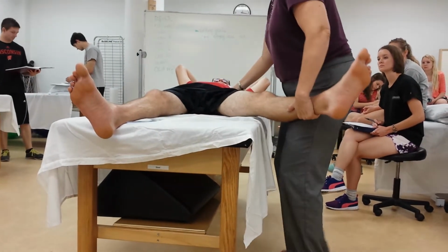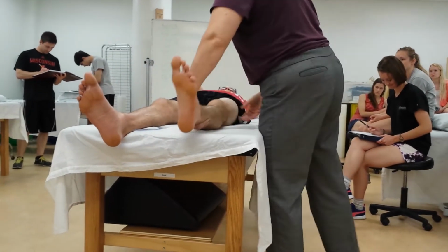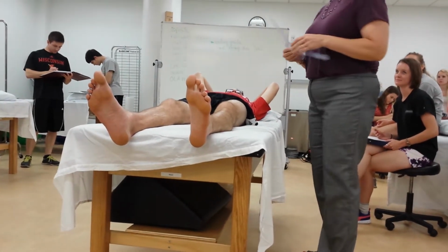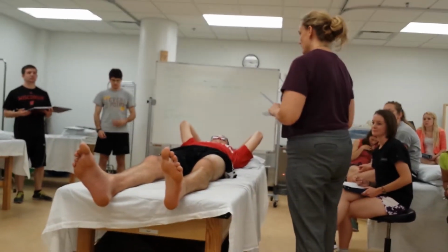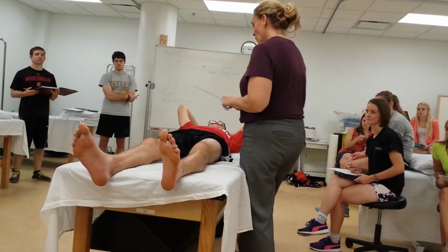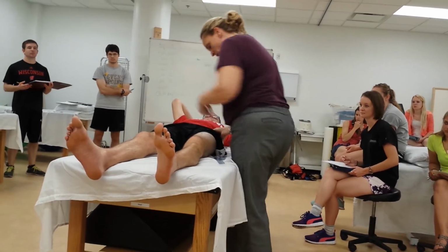All right, abduction. Going to feel for end feel. That's definitely muscular. Okay, so now we're doing a motion in an orthogonal plane. Where do you think the stationary arm would go? Between the two ASIS. So for this one, we are going to go across the ASISs. It's a little bit different than how we do shoulder abduction.